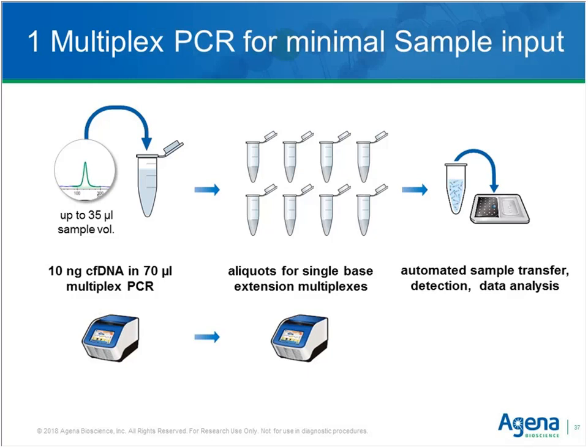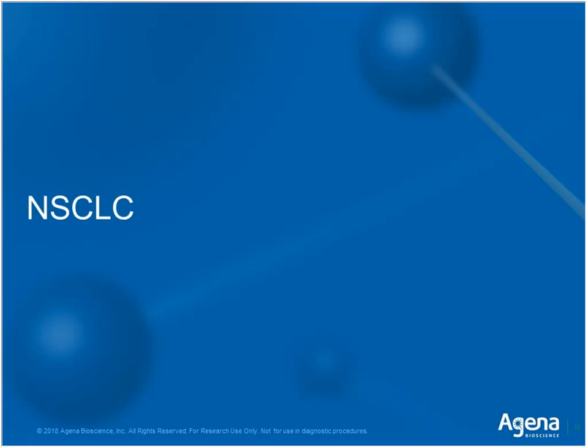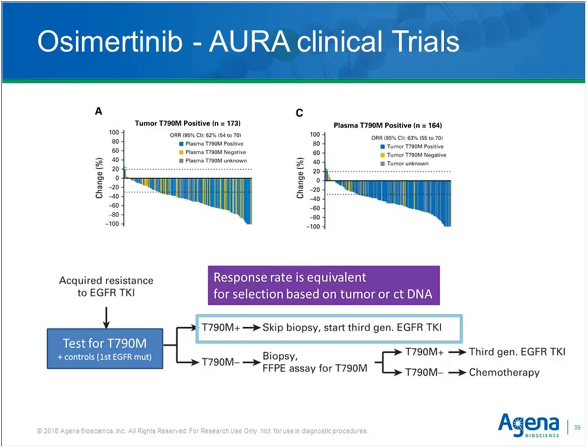Then we use various aliquots of that PCR for the interrogation of the mutations in the subsequent single base extension reaction. But enough about technology. It is time to talk a little bit about some applications and some examples of where liquid biopsy can make the difference.